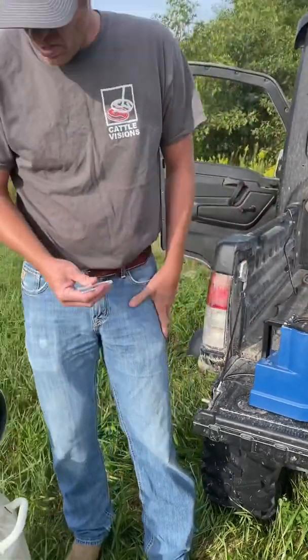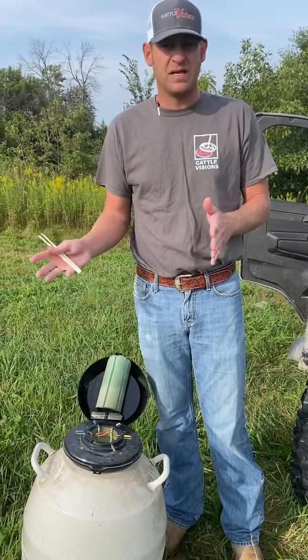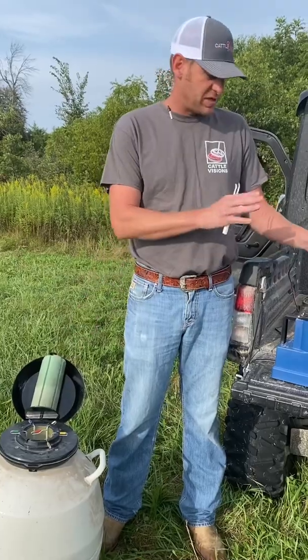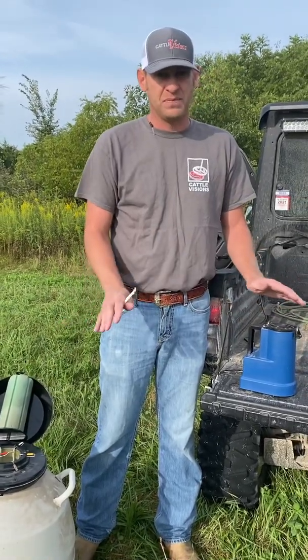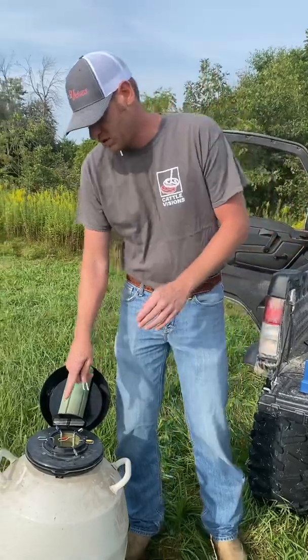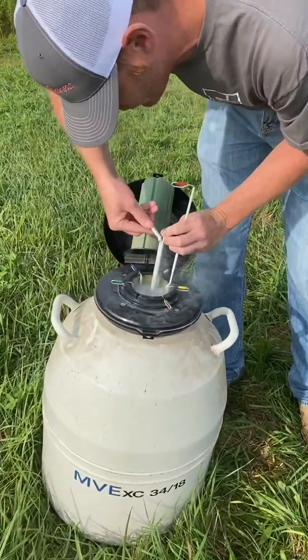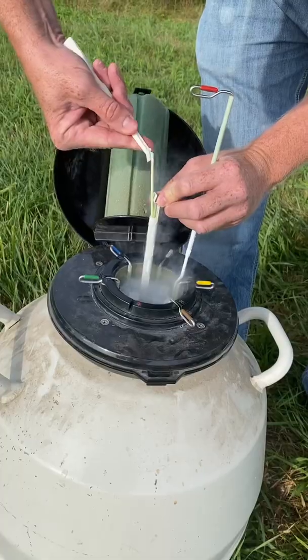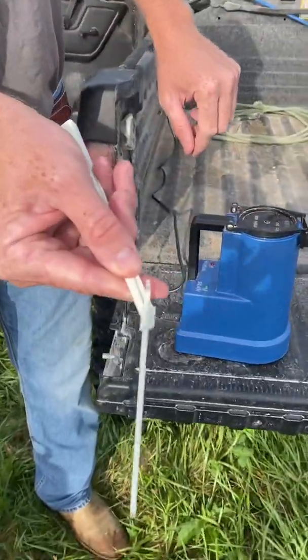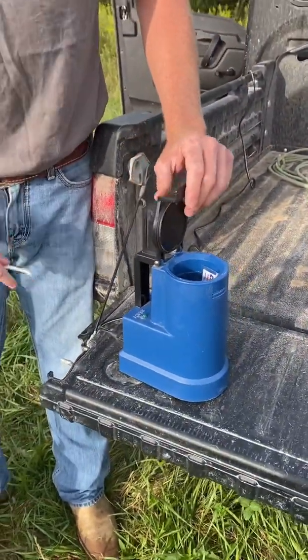Now I want to show you how to pull a unit of semen out to put into your thaw bath. At this time you need to have your semen identified for what you're going to breed to. Once it goes from your tank — the liquid nitrogen — to your thaw, you're committed. There's no turning back; that semen's going to open up, mobilize, and it's not going back in there. So I just pull a unit of semen out here with my tweezers, grab that guy, pull it out. We're going into the thaw bath — I've got my crimped end up, which is always the end that you cut and insert into the gun. We go in there, it's going to boil a little bit, and I close my lid.